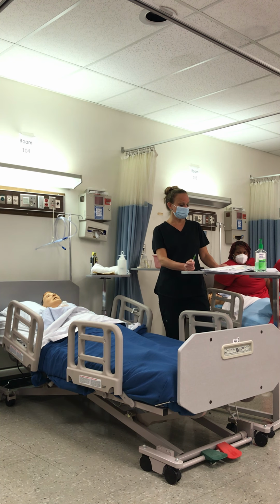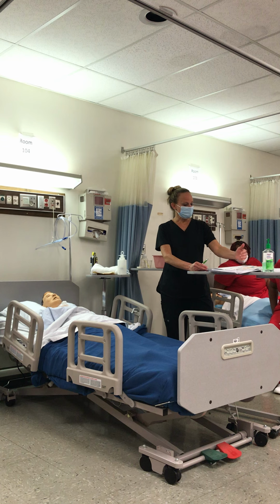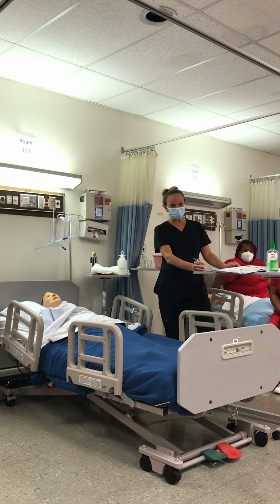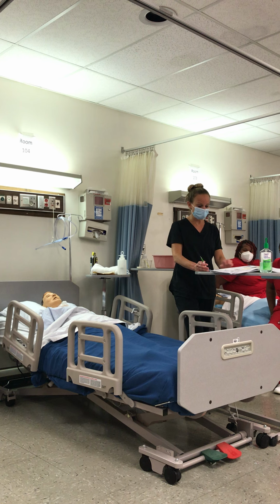Of course, whenever we get started, these sheets are great, and they pretty much follow the book. It goes by assessment, then planning, and then implementation, but it doesn't always fall in place how you need to do it. I know y'all realize that. But that is one way to break it down. We will be going in, identifying our patient, pulling for privacy. At that point, whenever I identify my patient, I'm going to make sure that they understand what's going on, what the purpose is, and that they're going to be getting an NG2.